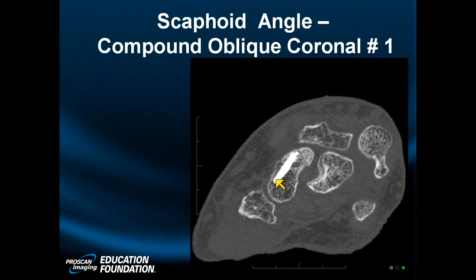Is this how we do our MRIs? You bet it is. Especially if we are looking at AVN and the character of bridging. But most of the time, when we're after pure bridging, CT wins, hands down.